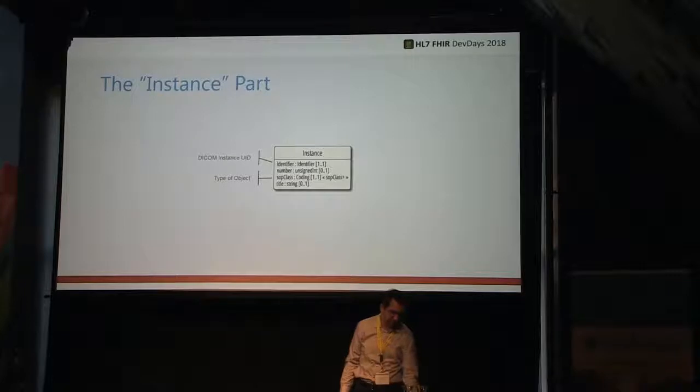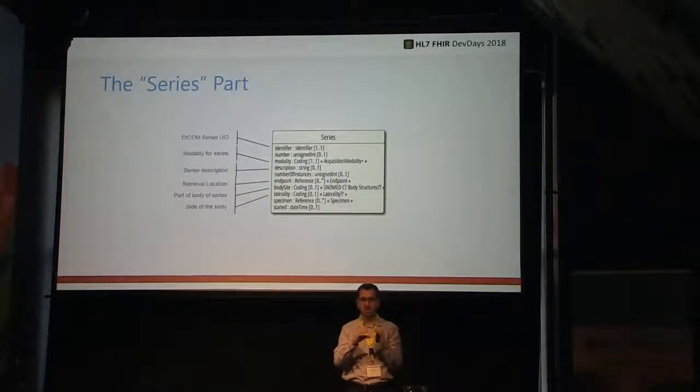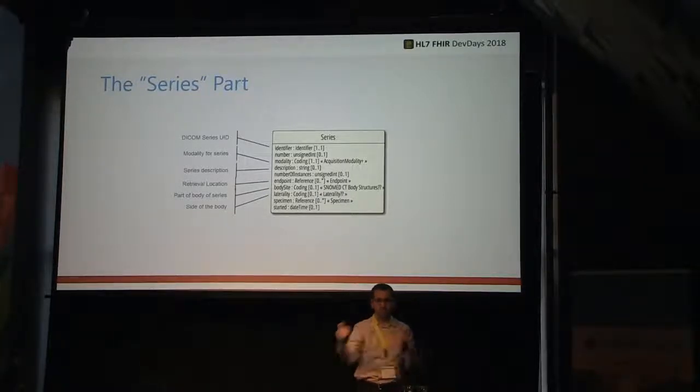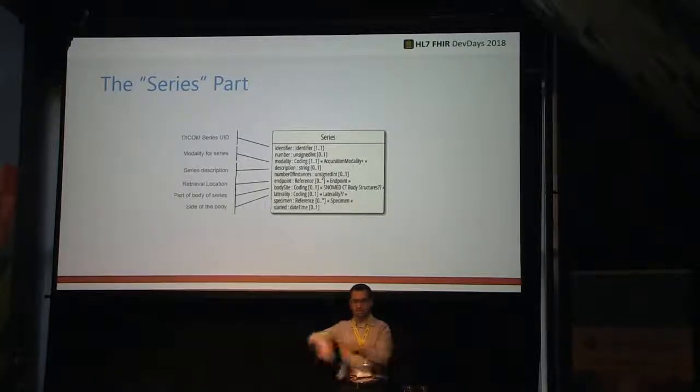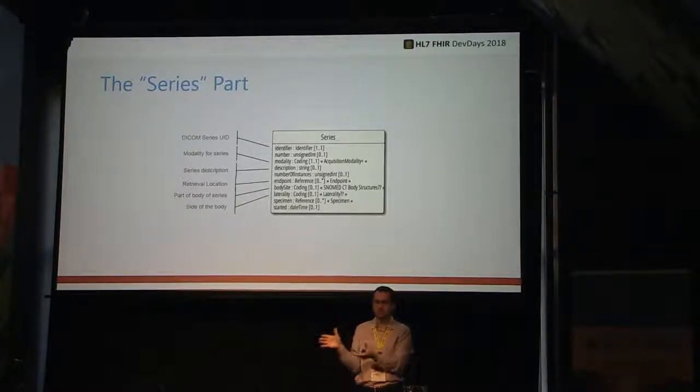That's a very good question. And actually what I would do is I wouldn't even use FHIR for that. I'm going to be very, very honest. In my experience, I've seen imaging study resources, but I don't usually see people actually bothering to create series and instance level resources in FHIR, because you could just go get it from the DICOM, and personally I think that's a more efficient way of doing it. They are there if you want to publish extra information to FHIR, just provide that information. But I would personally just go to the DICOM, because in this case it's the ultimate source of truth. It knows that stuff a lot better than the FHIR stuff does. I would just go to DICOM and get it.